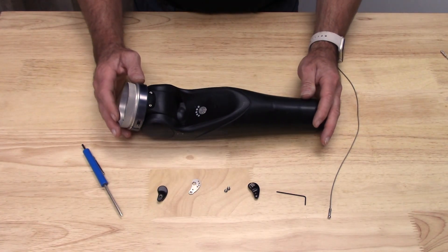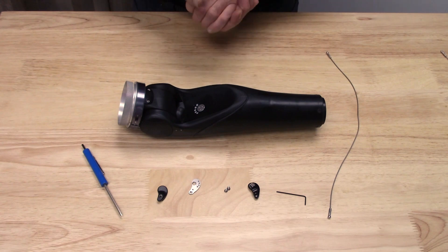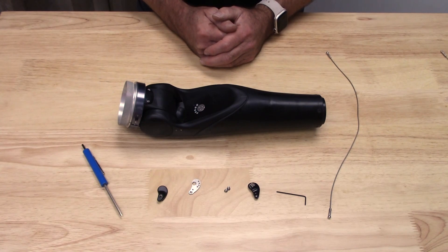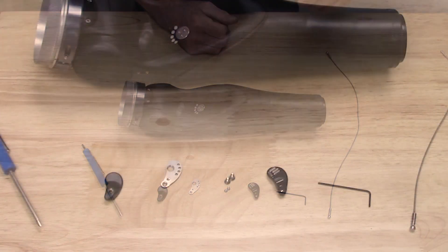I'm going to demonstrate installing the lift tab kit onto the motion arm. Just like the elbows, when you get the lift tab kit, it's going to be ready to go for left or right elbows, and that will determine which cover you use.